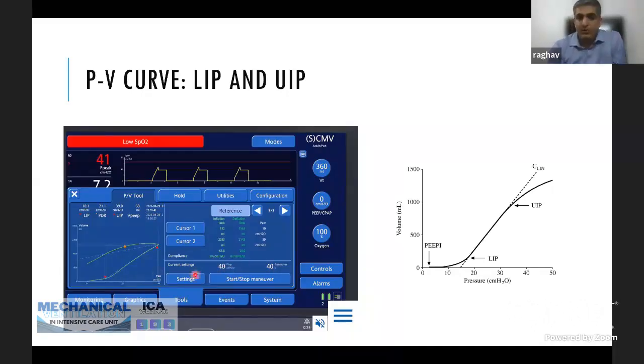So if you have this ventilator, you can construct a PV curve, and this point, where the slope of the PV curve initially changes, is known as the lower inflection point, which also denotes the opening pressure of the lung, and PEEP should be set above the lower inflection point. For example, in this patient, this comes to around 15 and PEEP should be set above 15.